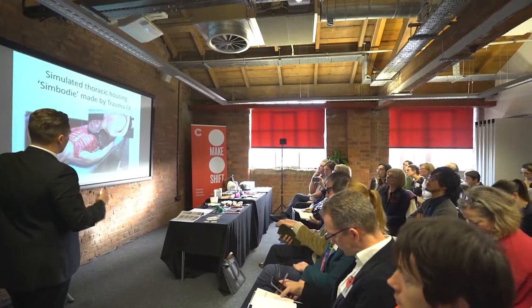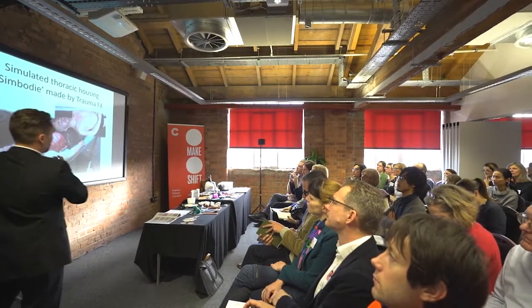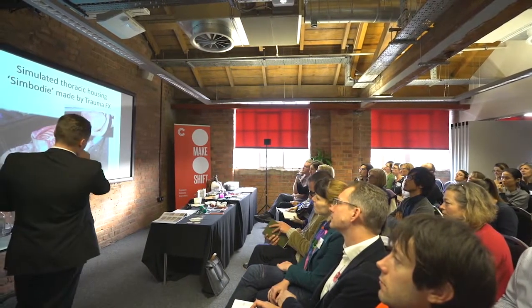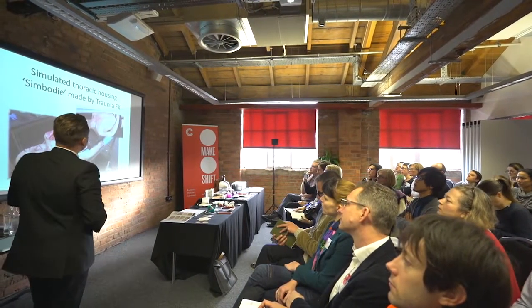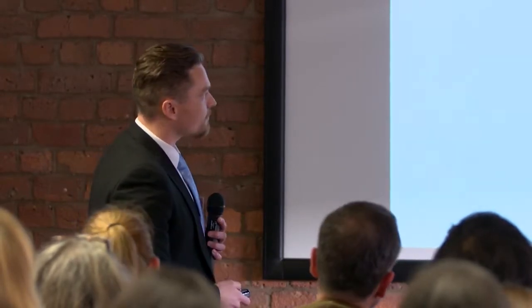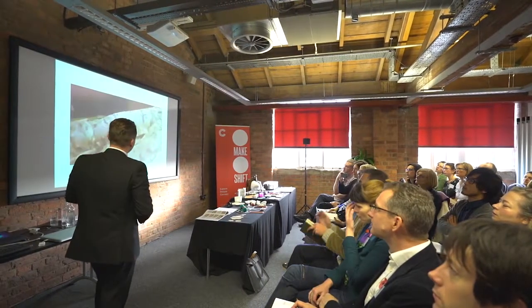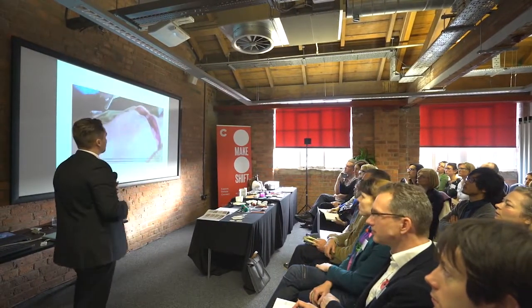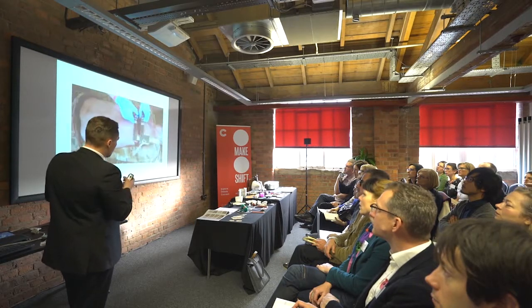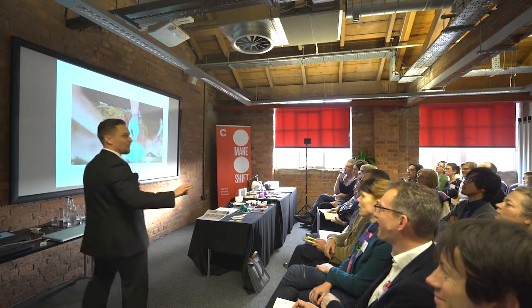It's literally all simulated. So what we've got here is a life cast of a living person made by Trauma Effects. It was then cast in silicone. You can see the internals here. This is in progress. And then, hopefully, this video is going to work. Will it work? It will work. So this is the finished simulated trauma surgery trainer. So this is all simulated. This is not a real person. Let me just reassure you.